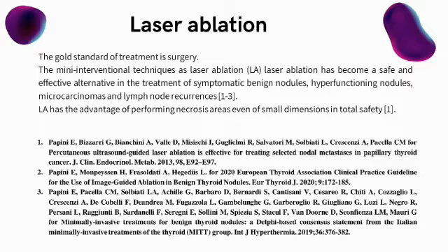Laser ablation can be used to treat symptomatic benign nodules, hyperfunctioning nodules, microcarcinomas, and lymph node recurrences. Laser ablation has the advantage of performing necrosis areas, even of small dimensions, in total safety.